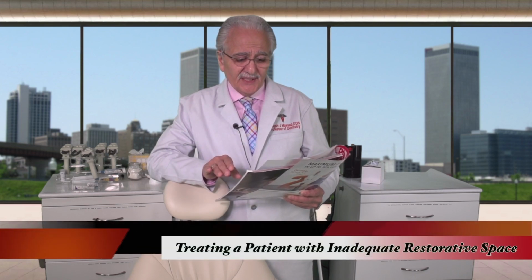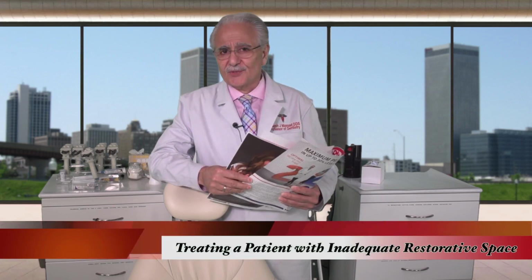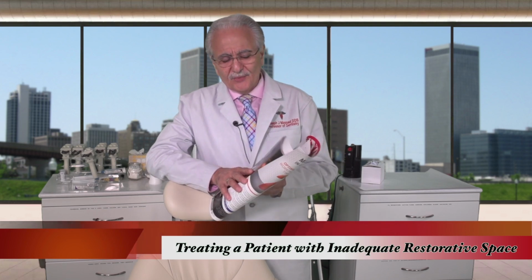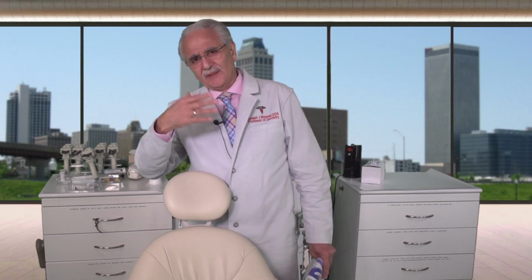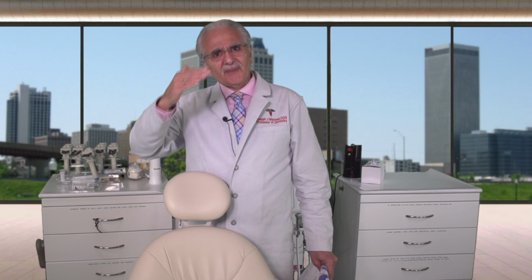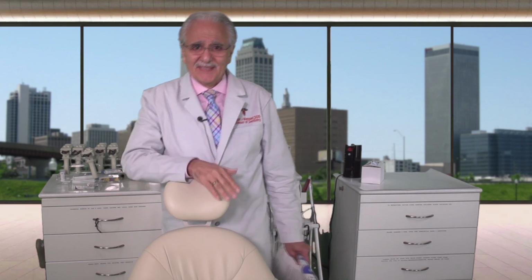My article, entitled Treating the Patient with Inadequate Restorative Space, I think is very, very germane today. Many times I see cases that come in who have implants, and I'm looking at the lower, and the patient's kind of complaining maybe they get food, and, well, that's normal. But then I take a look at the height of the lower incisors, and they may be sometimes as much as 10-15 millimeters above the resting lip position. Well, you can imagine what the occlusal plane looks like on these cases.